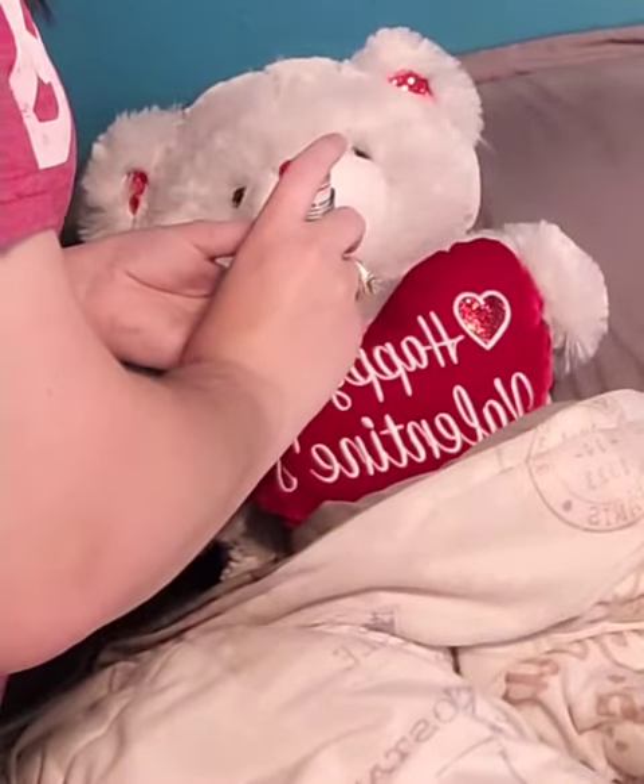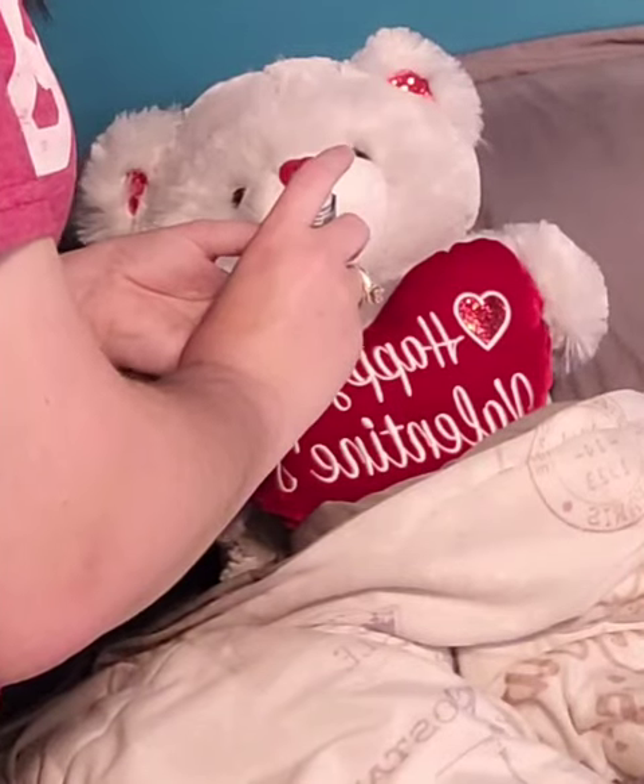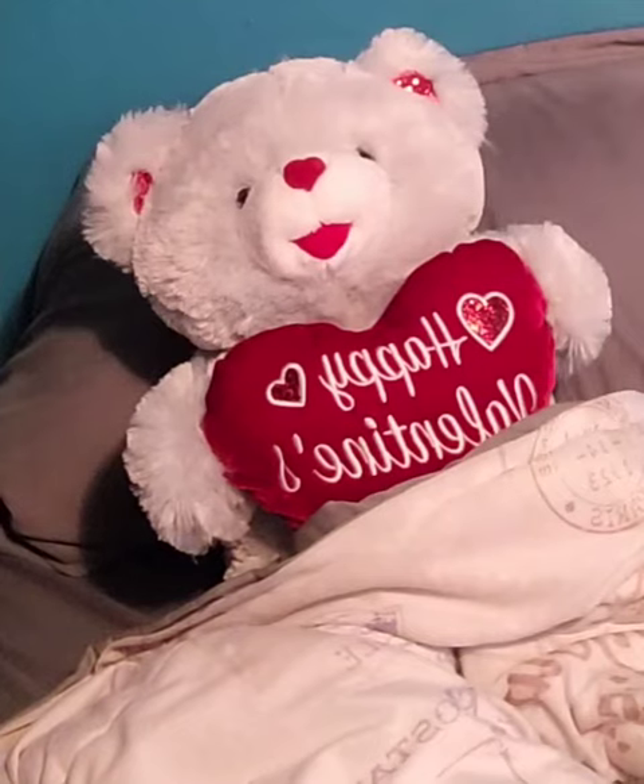Spray on the inside. Slow, deep breath in. Alright, and you'll hold it. Alright, and then you'll exhale.